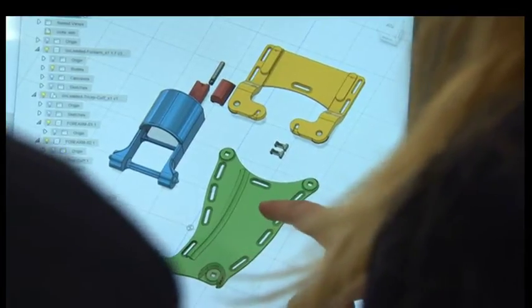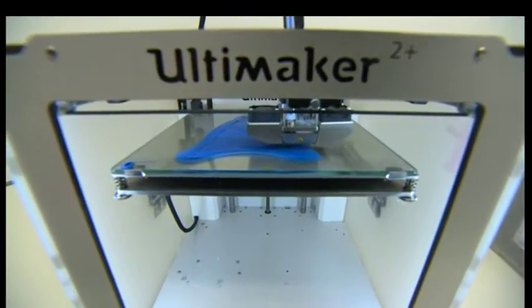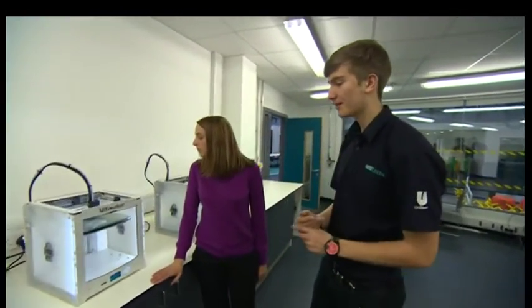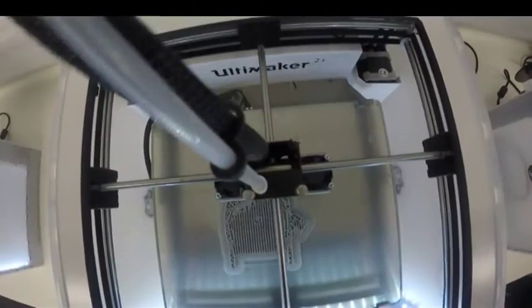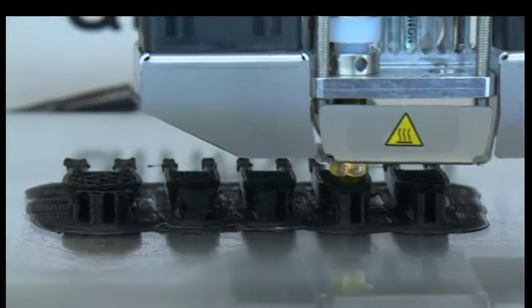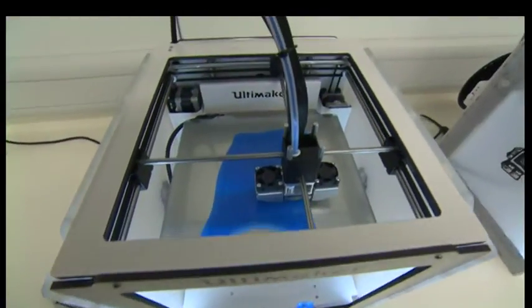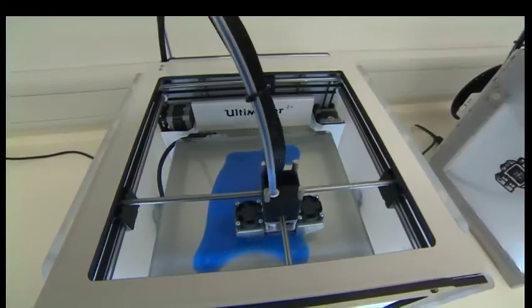The students tell the printers what to do and the printers get to work. On this printer right here, we have the palm part of the hand. This part will have the strings running through it onto the wrist. Right here we have the fingers, and here we have the main wrist unit that we print flat and then it gets moulded into the shape of your wrist.